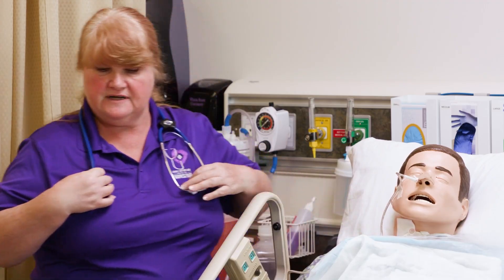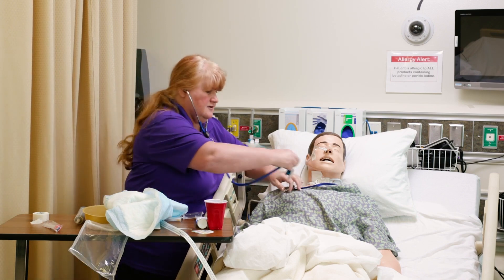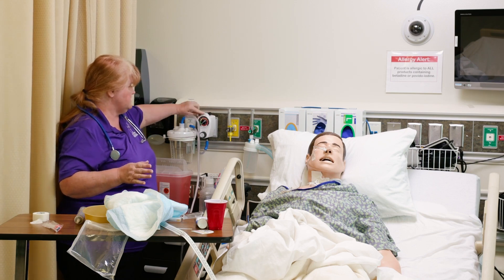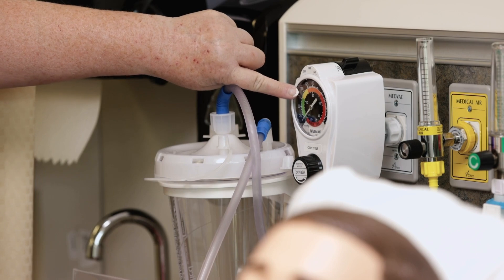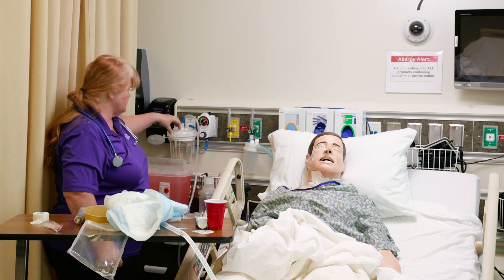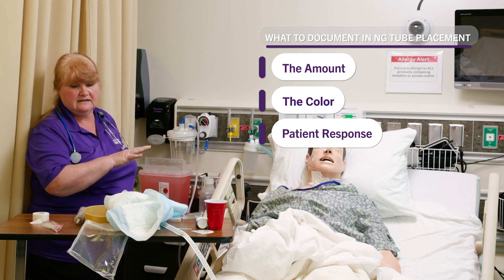Before we hook up the suction, we're going to listen again to the lungs as well as the breath sounds. Now we're going to look at the doctor's orders. Most of the time they will order intermittent suction, which usually goes up to about 125 — you don't want more than that. Occasionally they'll want it on continuous. Then you will watch the content come out in the container, and document the amount and the color, as well as how your patient tolerated the procedure.